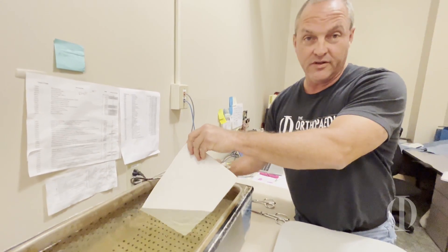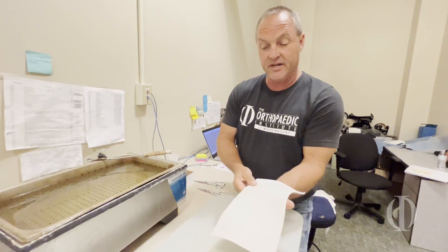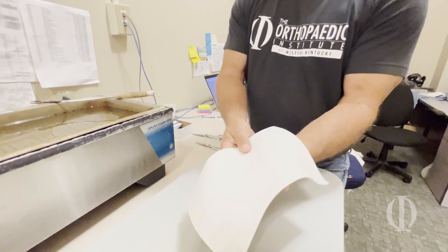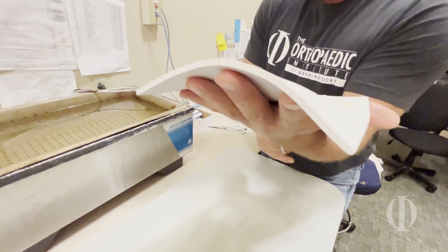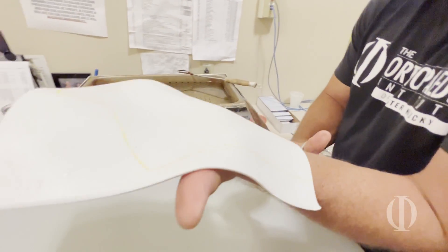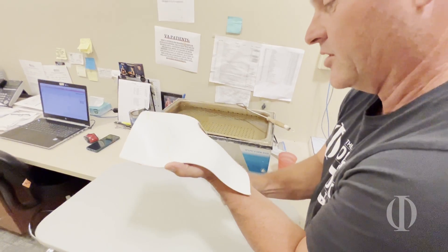My plastic has been in this water — it's about 160 degrees — for two or three minutes, and now you can see how pliable and soft it is. So now I'm going to cut along the lines from my pattern. It's really helpful to have good, sharp scissors.